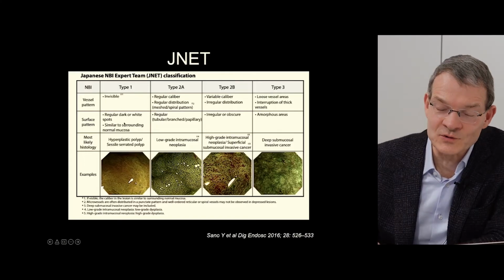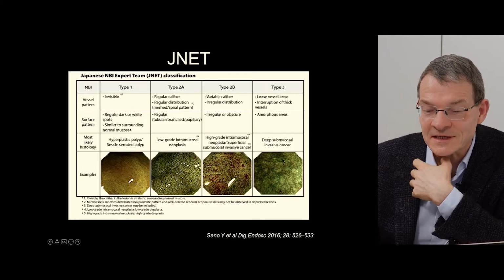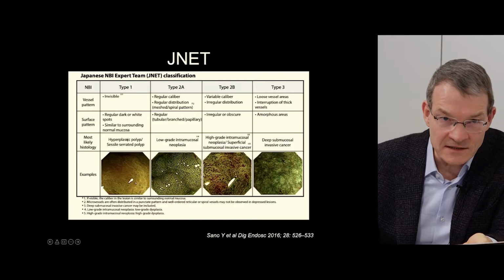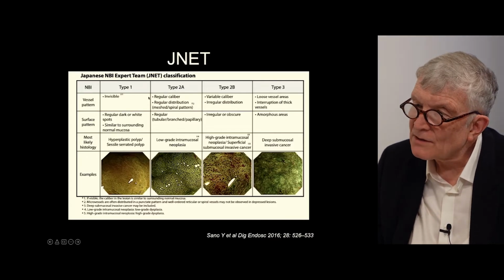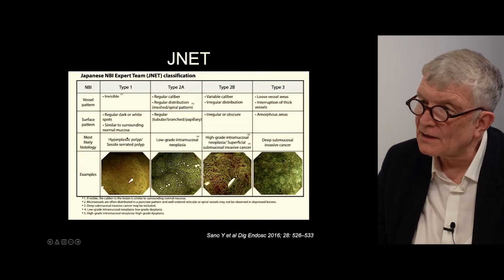So you notice it's somehow imperfect, because I think it would be better if we had type 0 with regular mucosa, and type 1 is then a serrated adenoma, but there's also already a mix somehow. And then some people say there's no hyperplastic polyp in the proximal colon. It's all sessile serrated lesion. So who cares?